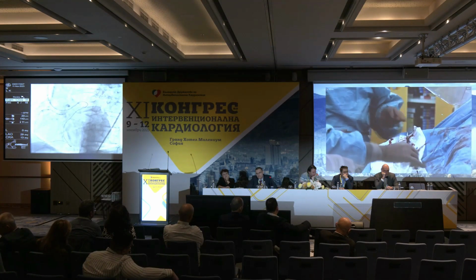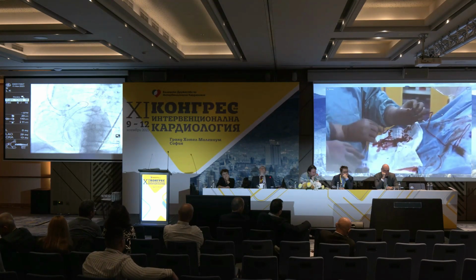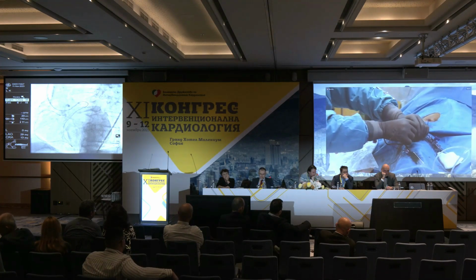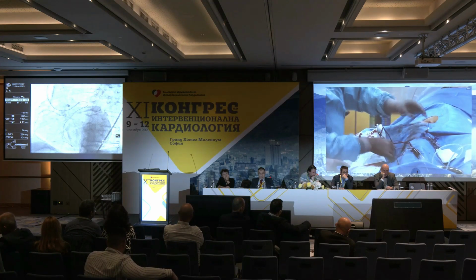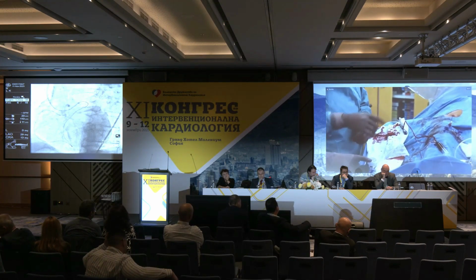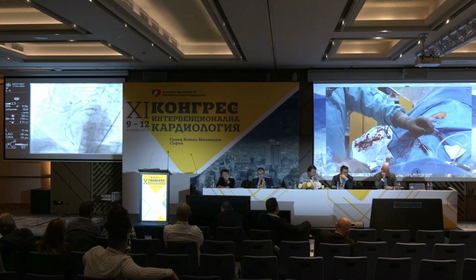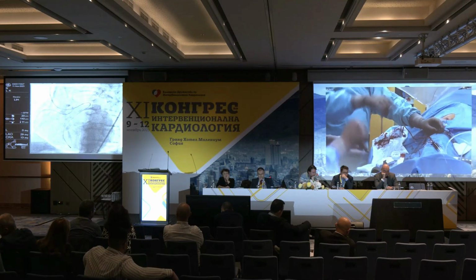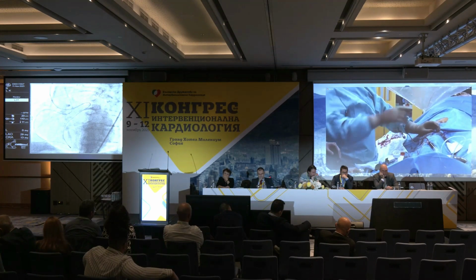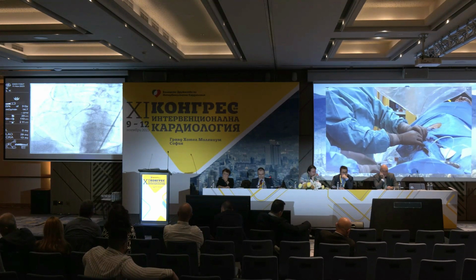Give me another run through, because we have to proceed now. So we have the externalized wire, as you can appreciate here. We have this wire which is externalized. I will advance a little bit more wire so we have more. And the next step is to retrieve the retrograde microcatheter. The way to do that safely, focus on my left main there. If I pull back the retrograde microcatheter, the antegrade guide, the retrograde guide might dive into the left main and might dissect. In the past, or even now, we are retrieving the retrograde microcatheter, the EBU, which I'm going to do, as you will appreciate here.